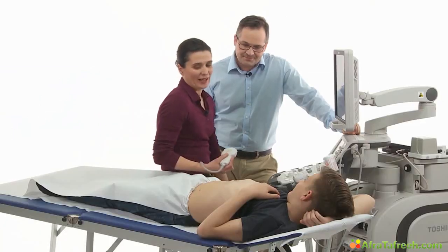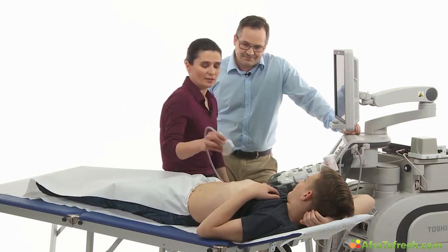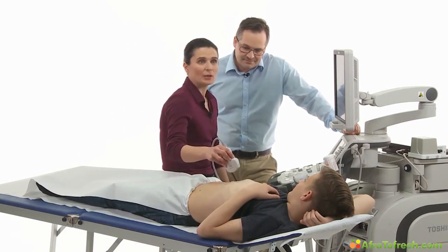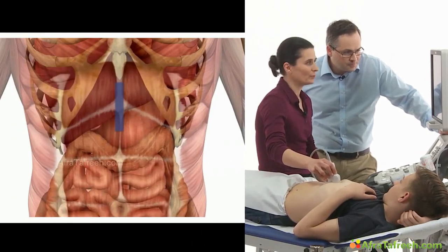Let's perform a scan of the liver. The liver is quite a big organ, so we need a systematic approach for scanning the liver. Can you show us how you do it? Yes. I start placing my transducer into the epigastric area in a longitudinal position, into the longitudinal epigastric view.